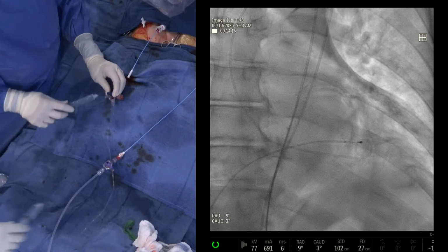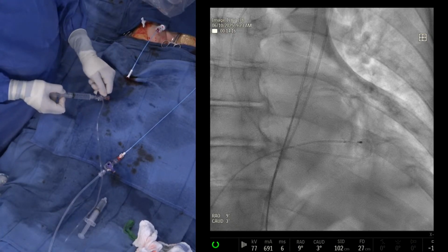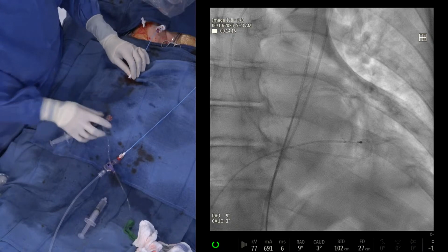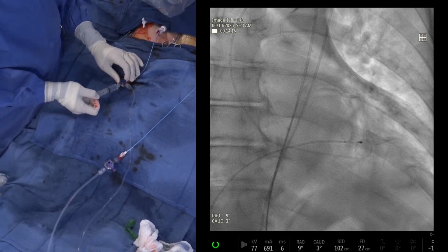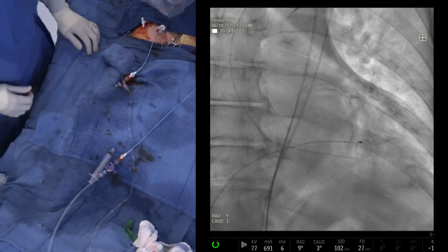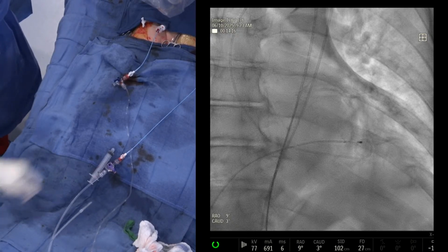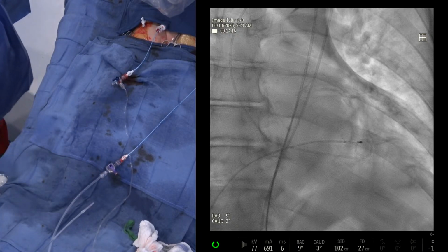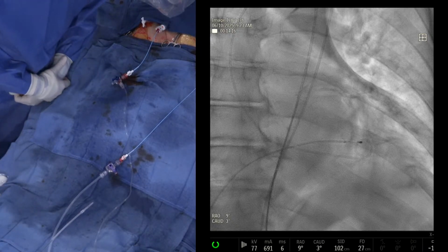Then what will happen? It will be a financial penalty to the institution. So therefore, just coming back to the point, Pedro, I think our policy has been now to do the TAVR first and then do the PCI later. Whether it's right or wrong, there are many studies which favor this approach. The examination and a few trials have shown that this approach of PCI after TAVR is probably the best one, although there is no randomized comparison that way.